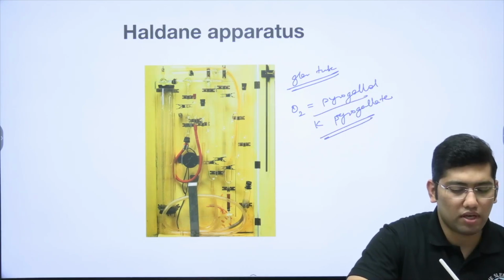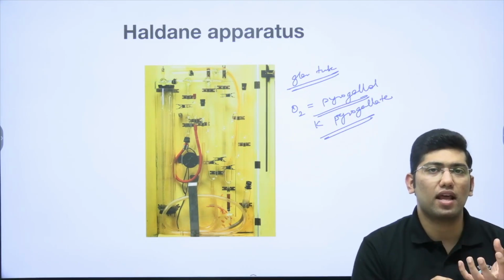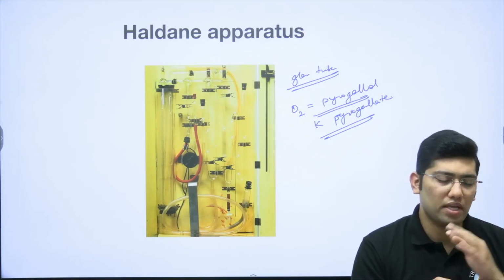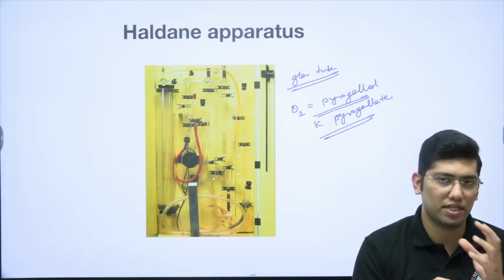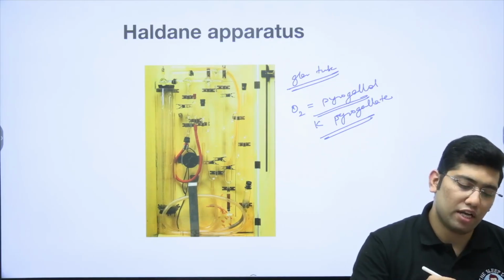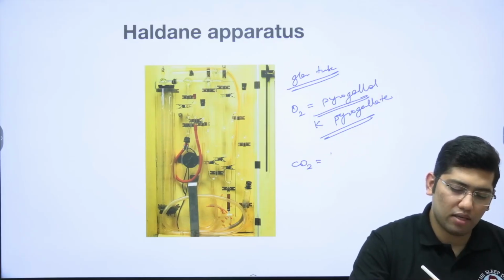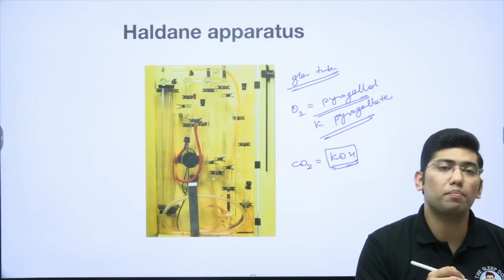The sample was exposed to this substance, which rapidly absorbed oxygen. How much ever oxygen was absorbed was analyzed, giving the oxygen concentration in that particular sample. To analyze carbon dioxide in the same apparatus, potassium hydroxide can be used instead of potassium pyrogallate.